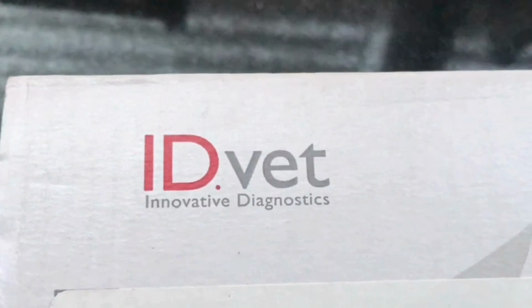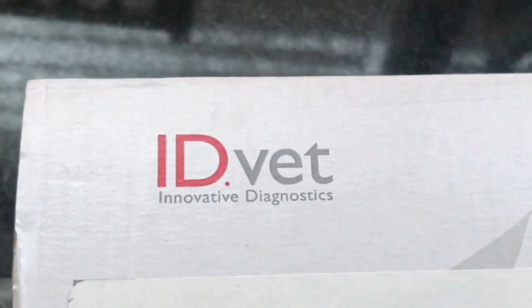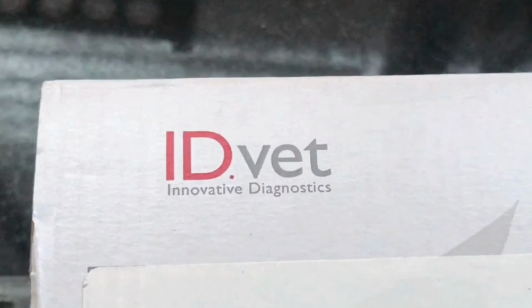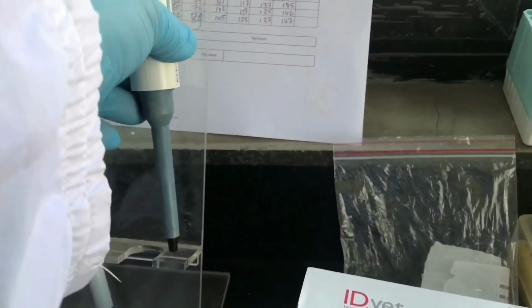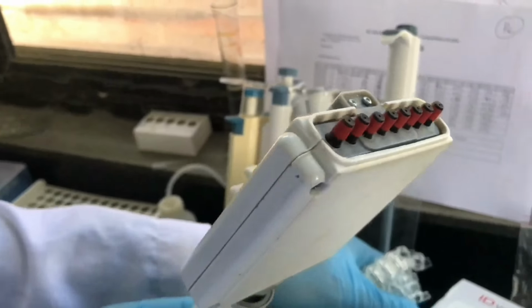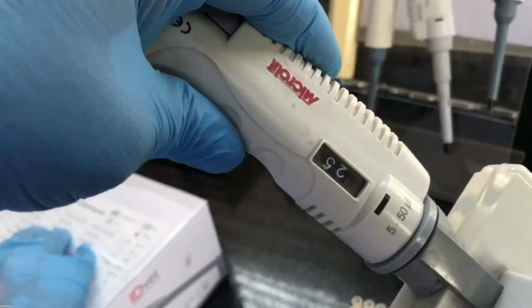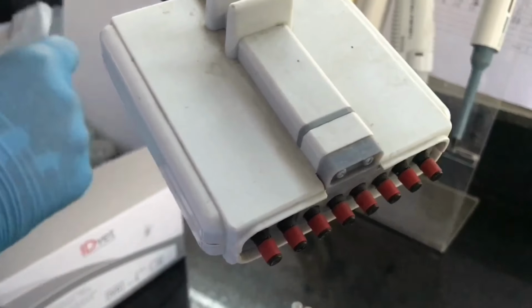The ELISA kit that we are using today is for PPR. It is produced by IDvet, which is a company that produces ELISA kits and other products like this. So these are micropipette tips that we will be using in the micropipette. And these are the micropipettes that we will be using, and this one is the multi-channel micropipette that can transfer reagent into 8 wells of the 96 well plate at a time, so we can adjust the volume from here.